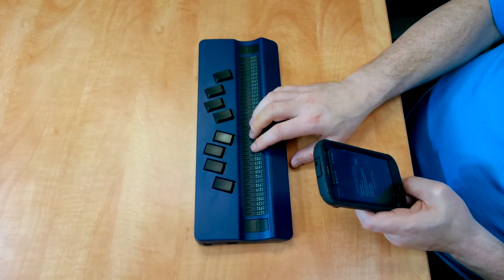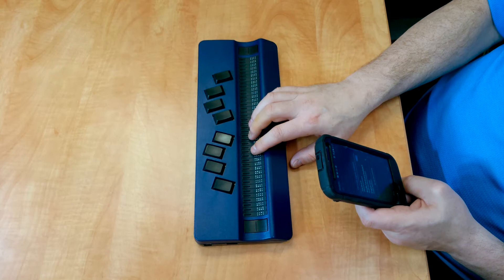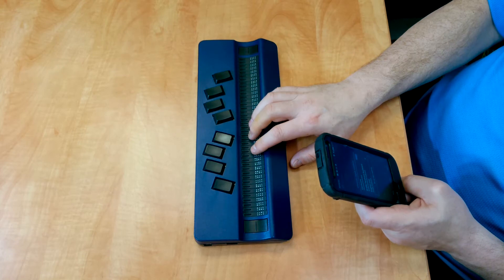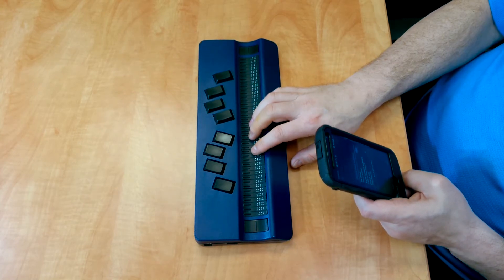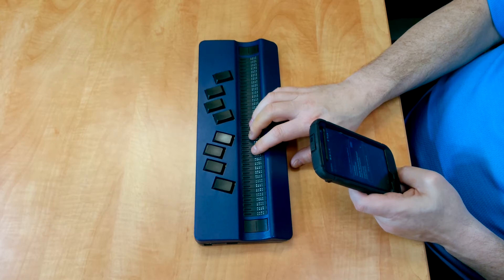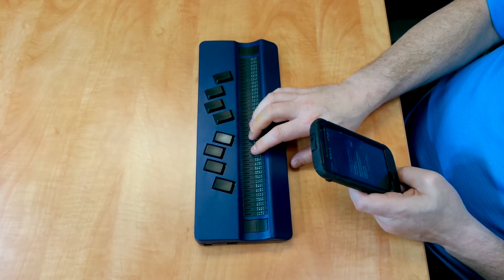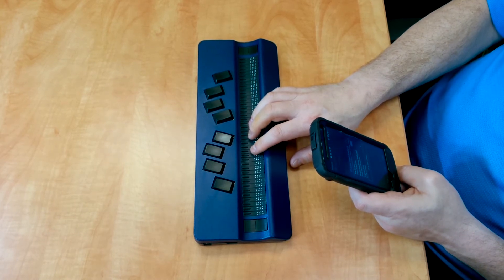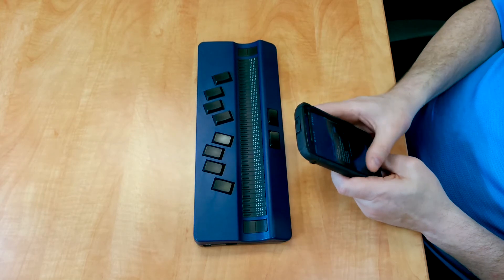If you want to use the Active Braille as a keyboard and control your Android device, you need to go into Settings on your Android device, go into Language and Input, and make sure the Braille back is checked. So I'll do that now.